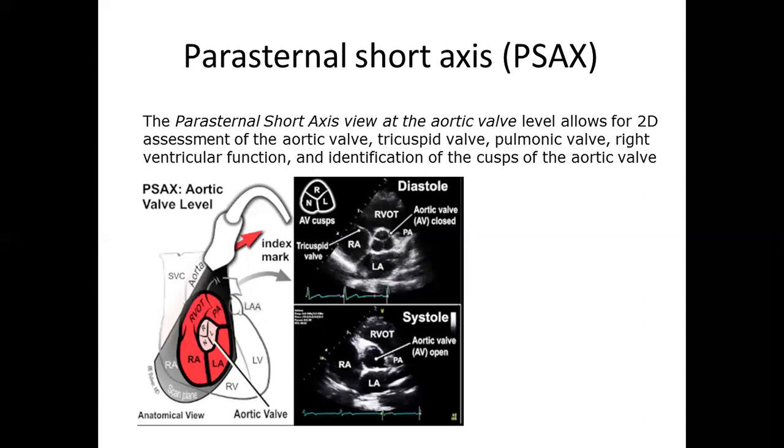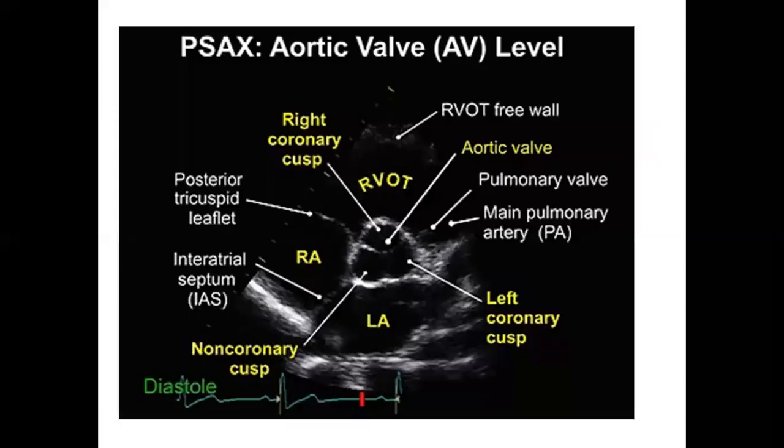So we can see the right ventricle outflow right there. So here is a bigger picture, but almost the same picture which you may see. Right there, you are also seeing this interatrial septum, which is useful if your patient has some interatrial septal defect.